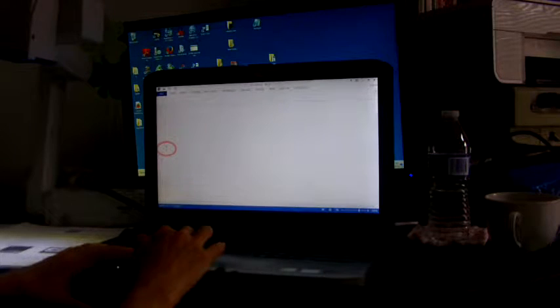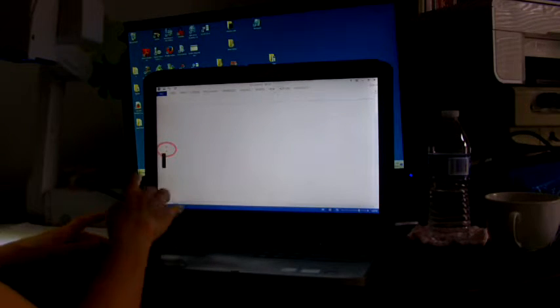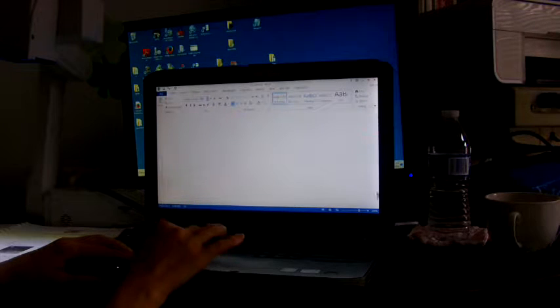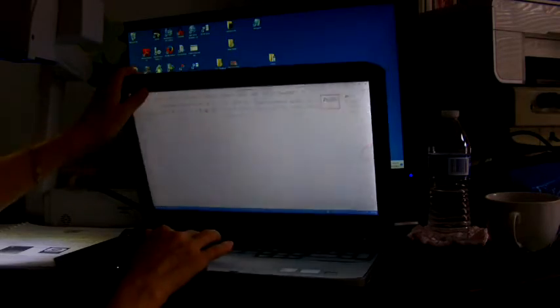So let's make a larger font, because when I noticed earlier when I did Control Plus, it made the eBot larger and the font on this larger, and it was extremely confusing. So there we go, we have a 36 going on here, which will be helpful for the document. Now let me go back on the other screen.